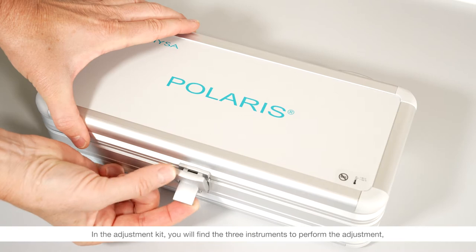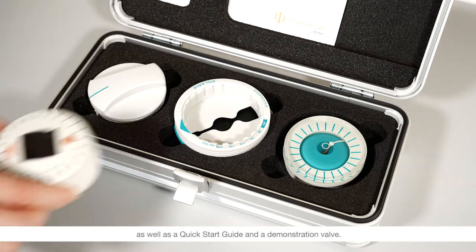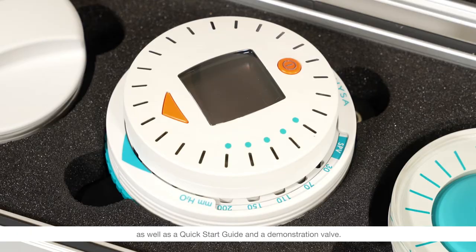In the adjustment kit you will find the three instruments to perform the adjustment, as well as a quick start guide and a demonstration valve.